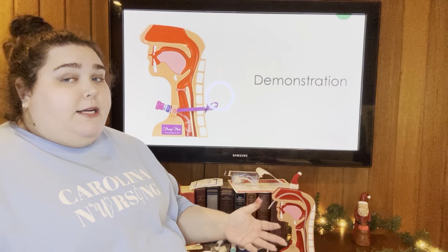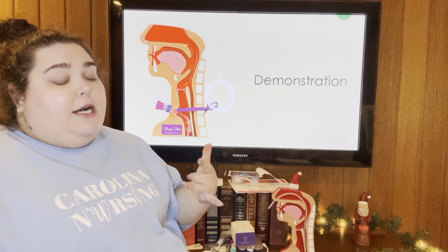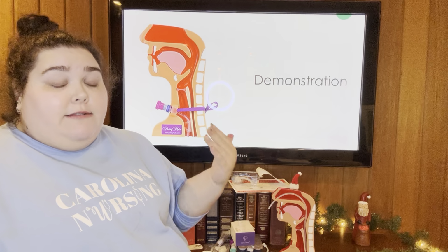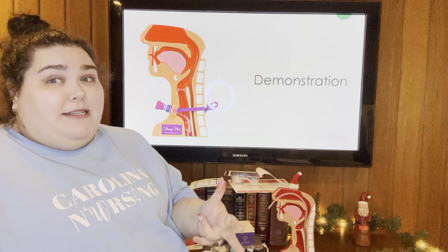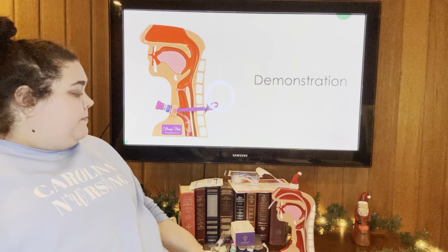A really important point she brought up was with the trach ties. We want to make sure that we're replacing one side at a time. The leading cause of accidental decannulation of a trach is loose ties, and it often happens in that changing period. So that's an area that we want to be careful on.